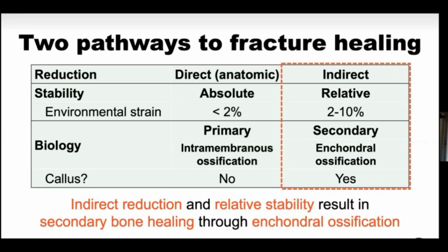We're going to talk about how to use different plates and what vocabulary we use and what the goals are of different types of plate fixation. But it's important to understand that, as Dr. Haynes mentioned, you may also see different mixed modes of fixation or mixed modalities as well. And it's not necessarily wrong. It's a surgeon trying to adapt the fixation to the location of the bone and some of those other things to answer some of the questions that we talked about: what patient factors, what injury factors, what bone factors can all contribute to what the fracture needs?